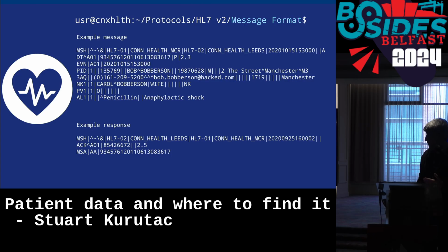Then the HL7 interface that you're sending that to will generally send this example response below, which is an acknowledgement. So again, it's got the sending application and facility, where the receiving ones were at the top, and so on and so forth.